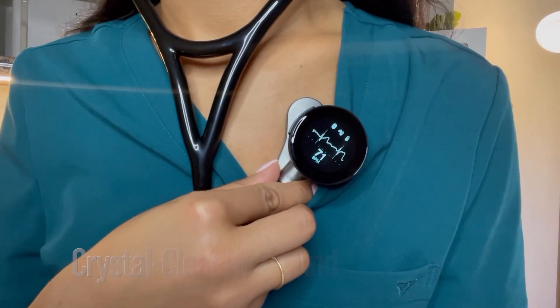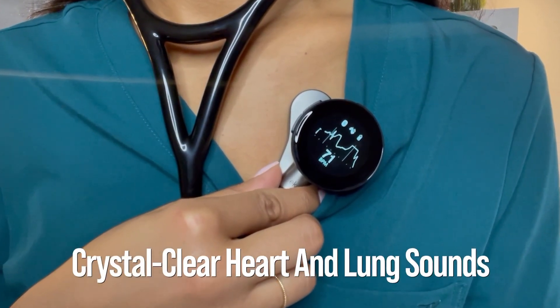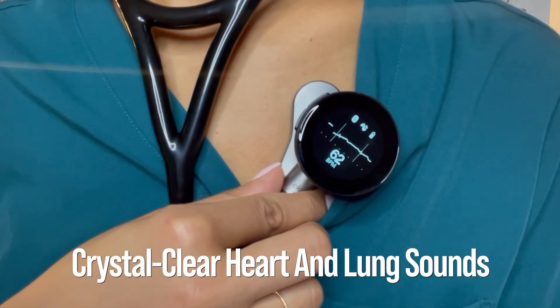The most important part of any stethoscope is its sound quality, and the Echocore 500 shines in this department. Its digital amplification provides crystal clear heart and lung sounds, making it easier to detect subtle murmurs or abnormalities. One thing that amazed me was the active noise cancellation feature — it minimizes distracting background noise, ensuring you get a clear auscultation even in a busy environment.